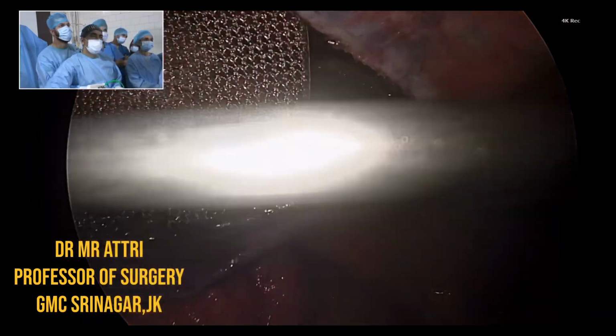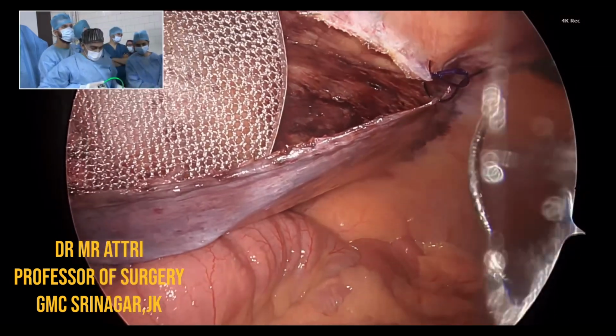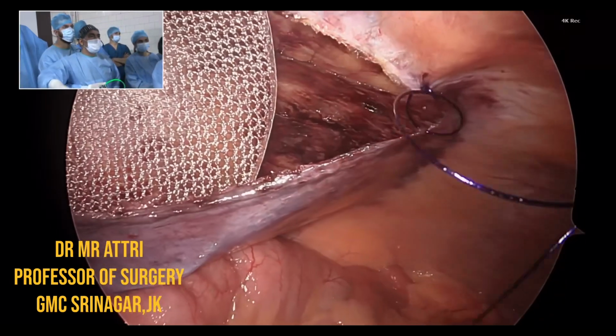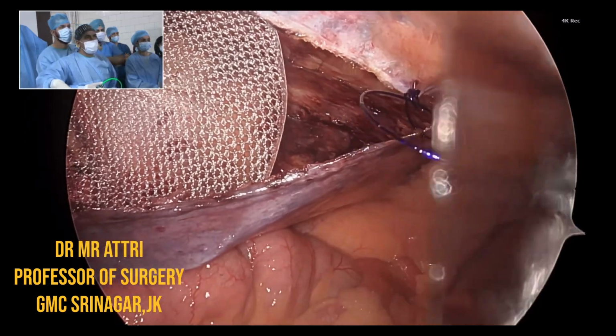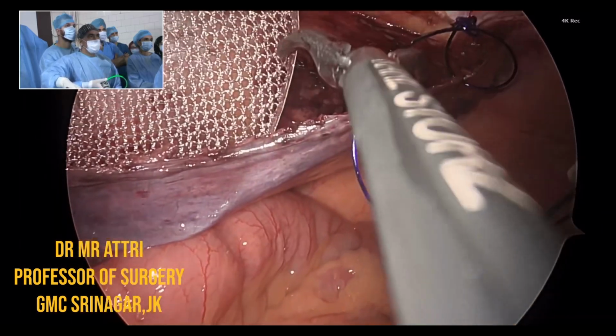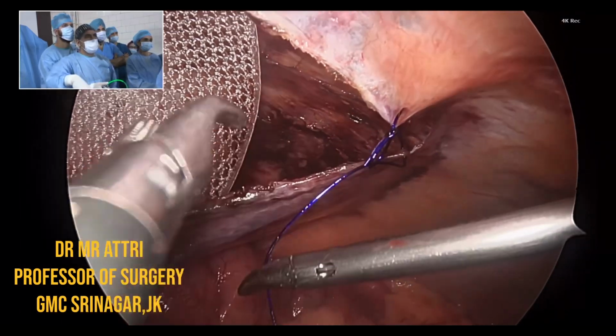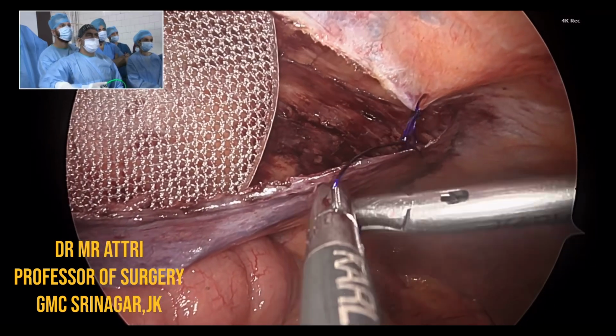How will you manage the seroma? Sir, I think we should wait. There is no need for aspiration and re-aspiration. We watch these patients, follow them for 3 weeks, 6 weeks, until they resolve. Most of them resolve.